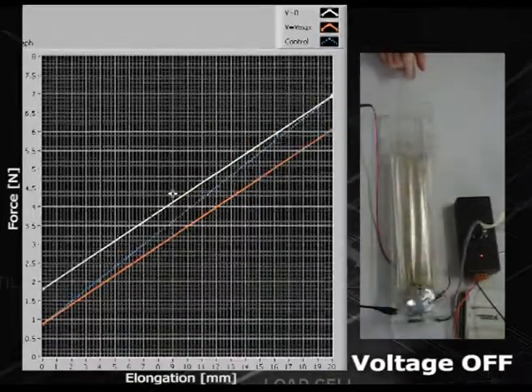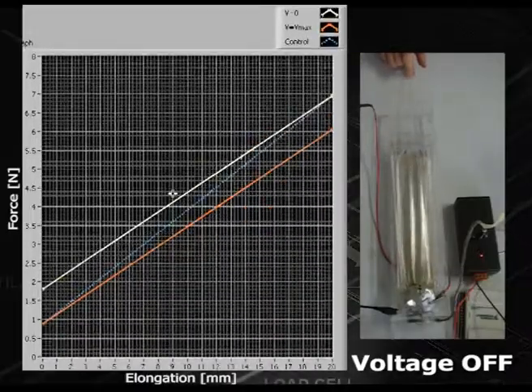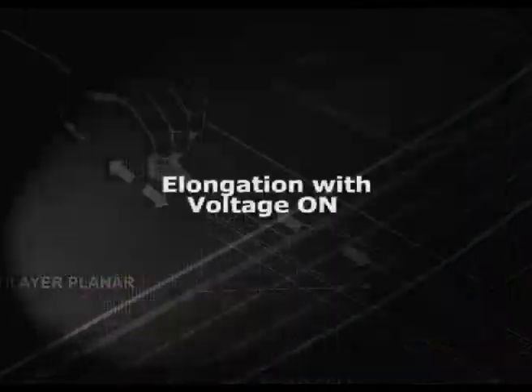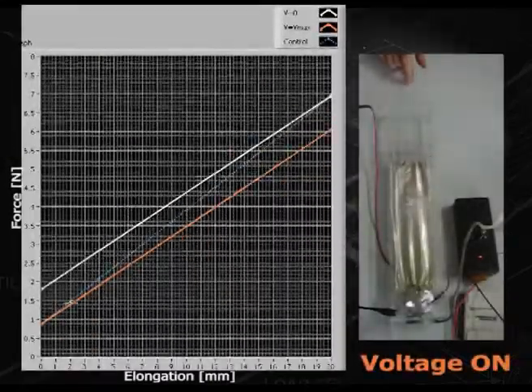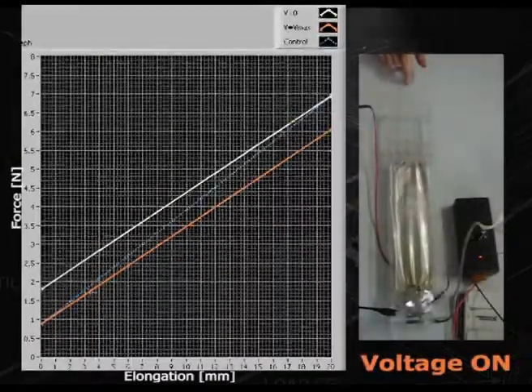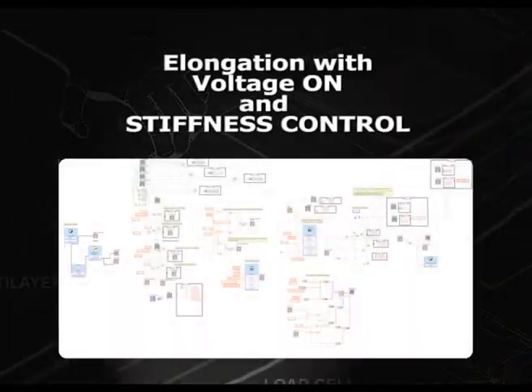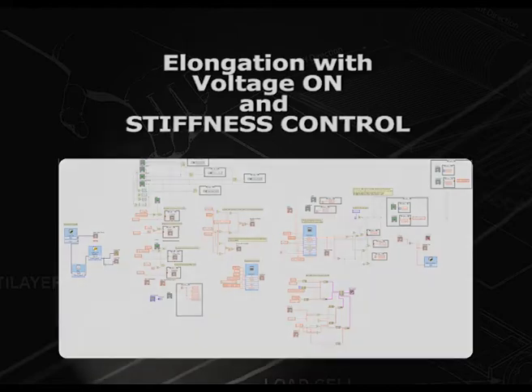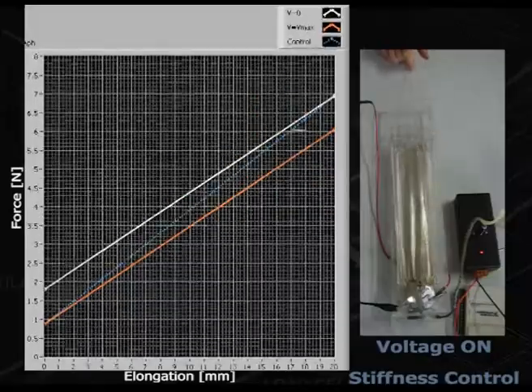This video shows that when the voltage is off, the actuator follows the white curve in the force-elongation plane. When constant voltage is on, the actuator follows the red curve. Since the stiffness doesn't change much between the off and on states, we implemented stiffness control with LabVIEW. As a result, we were able to control the stiffness.